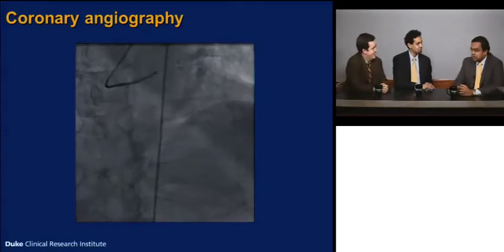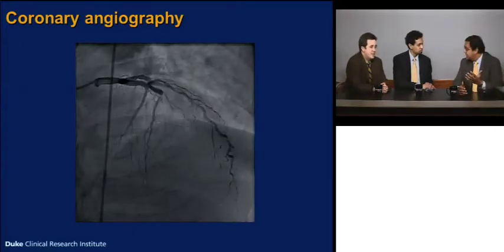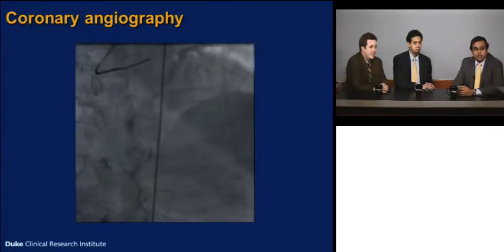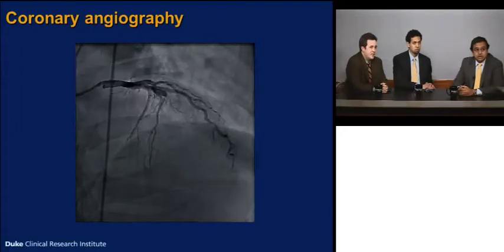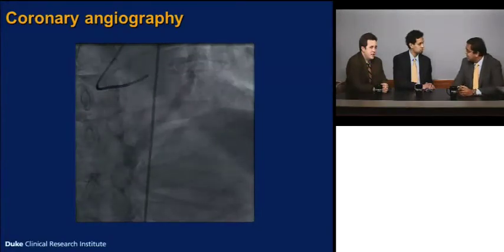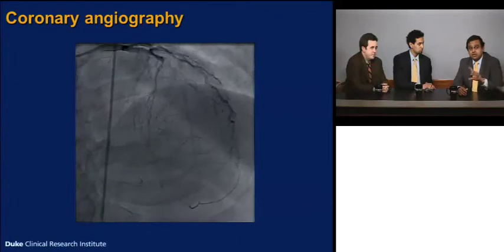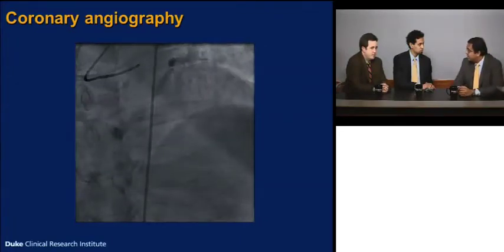Well, tell us what you guys did here. You did a heart catheterization. I'll tell you what I see, and you can tell me. Absolutely. I see that they're injecting the left coronary system, and the LAD, at least midway down the vessel, has 100% occlusion with a fairly robust collateral coming some from the left side. But more concerning is that there's also collateralization going to the right coronary on this image. So just in this image, if I was taking the picture, I'd be concerned that not only do I have one large vessel territory, but now the right coronary might be affected too.